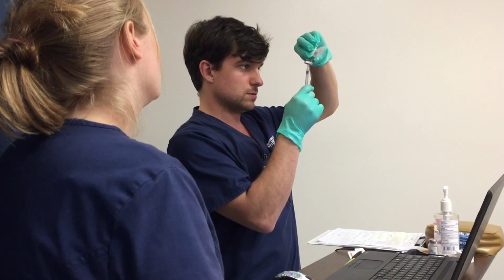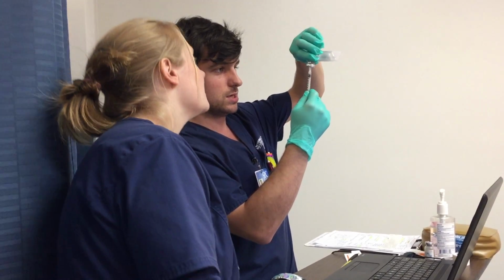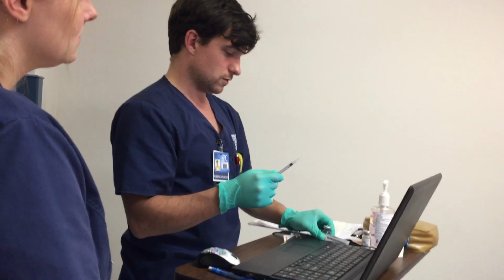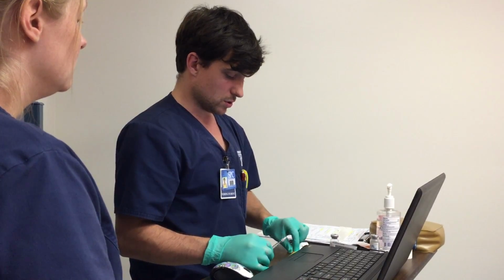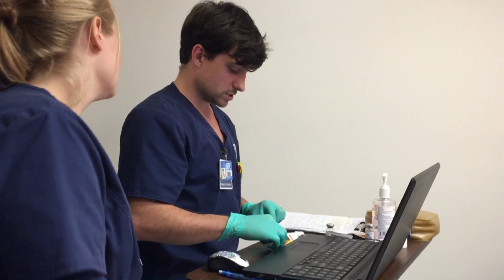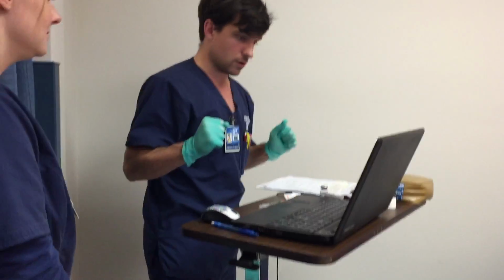Great. Can you verify that that's 6? Perfect. Thank you so much. Now, one of the critical things here is to make sure that we don't recap it with our fingers. So we're going to just slip it in, okay? Now it's just there and ready for our use, okay?